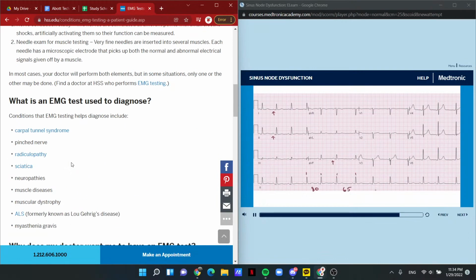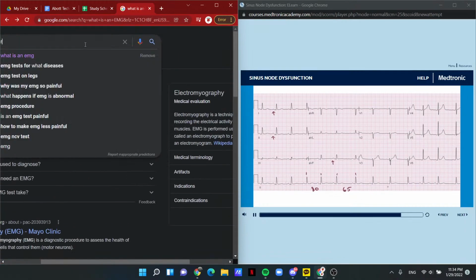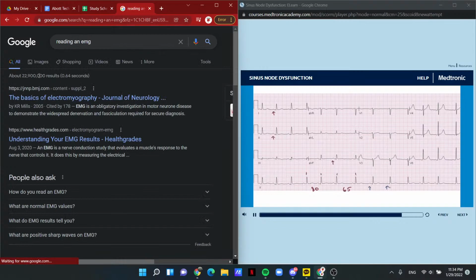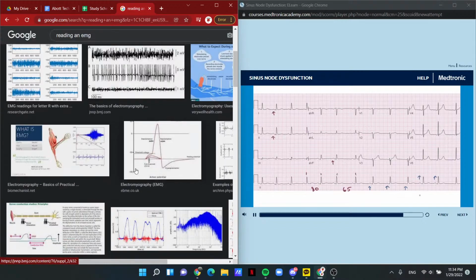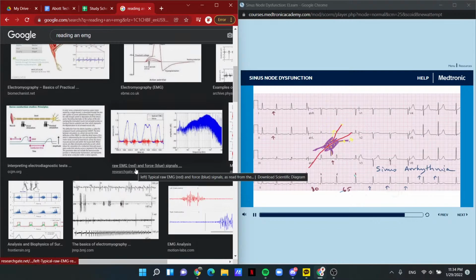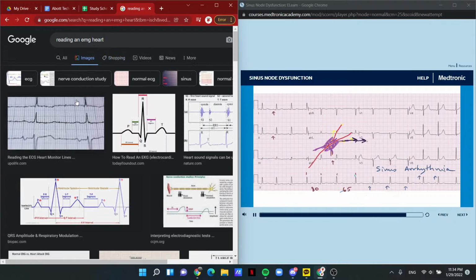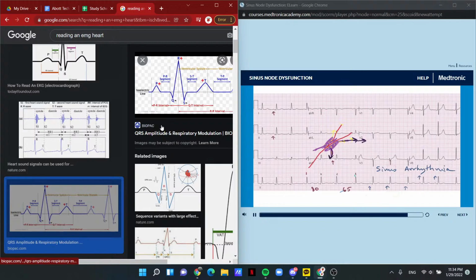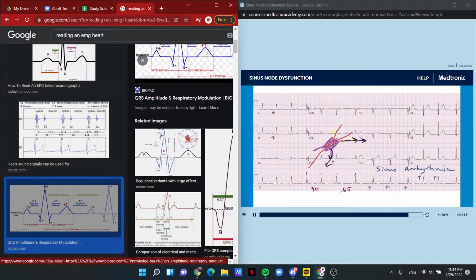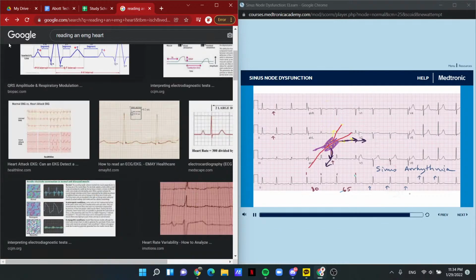You can also detect slight changes in the P wave size and shape. Although all the P waves are upright, you can see that some of the P waves are flattened compared with others. These minor changes in P wave morphology are normal in cases of sinus arrhythmia. And it's most likely due to the fact that during sinus arrhythmia, faster beats exit the sinus node from higher, more medial extensions. And with slowing of the sinus node, the impulse tends to emerge from a lower, more lateral extension. This results in very slight alterations in the P wave morphology.